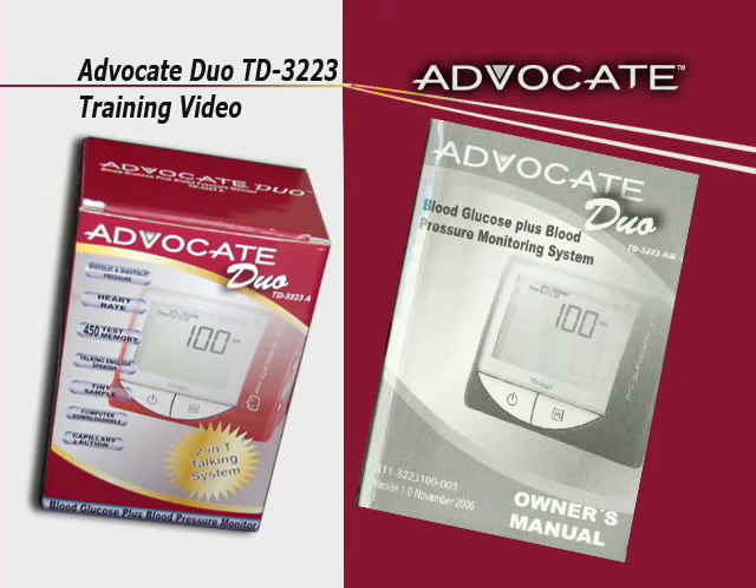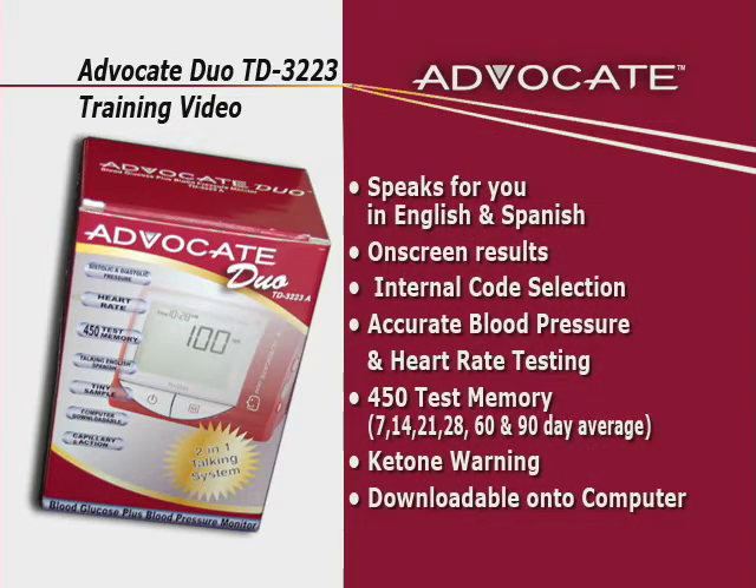Blood glucose and pressure monitoring plays an important role in diabetes control. Approximately 70 percent of diabetics also suffer from hypertension. The results you get with the Advocate Duo TD-3223 system can help you and your health care professional monitor and adjust your treatment plan to gain better control of your diabetes.